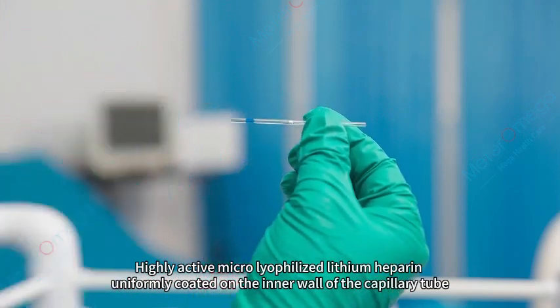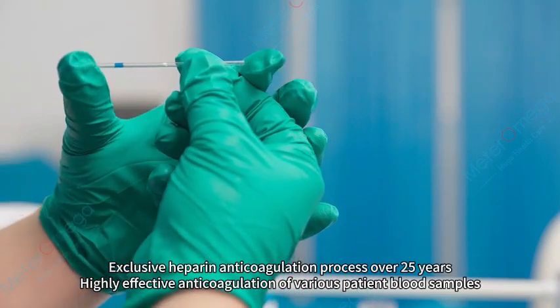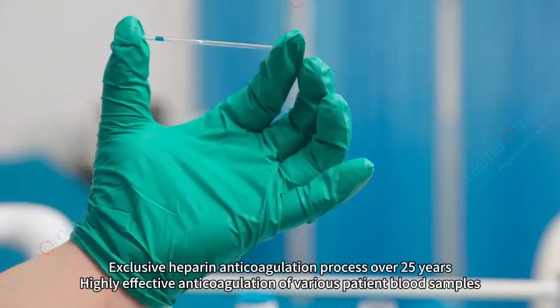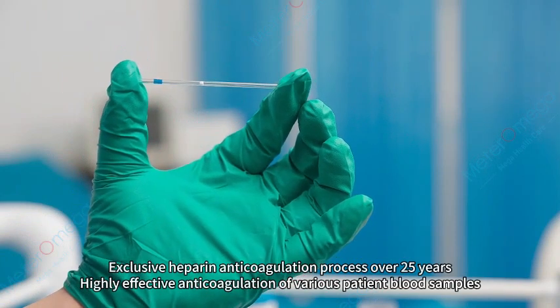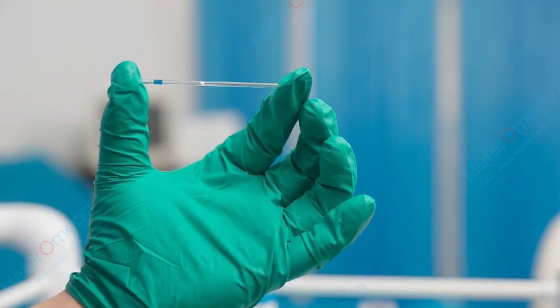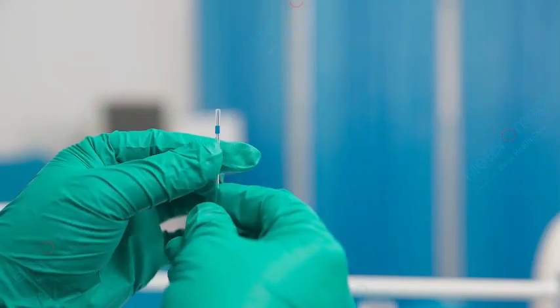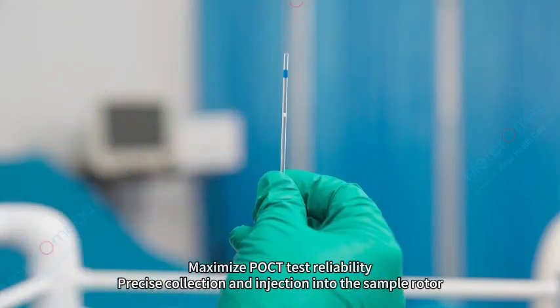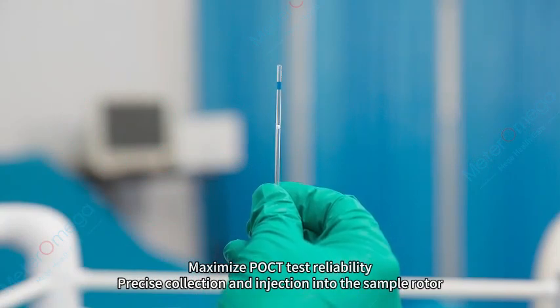The lithium heparin is uniformly coated on the inner wall of the capillary tube using an exclusive heparin anticoagulation process developed over 25 years. This provides highly effective anticoagulation of various patient blood samples with a fixed volume of 100 µL blood collection, maximizing POCT test reliability through precise collection and injection into the sample rotor.